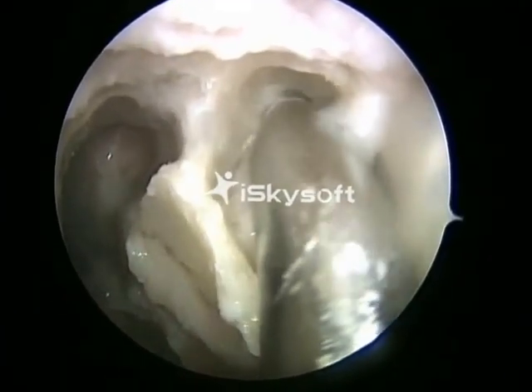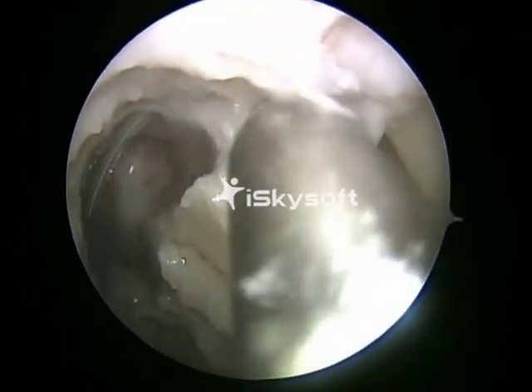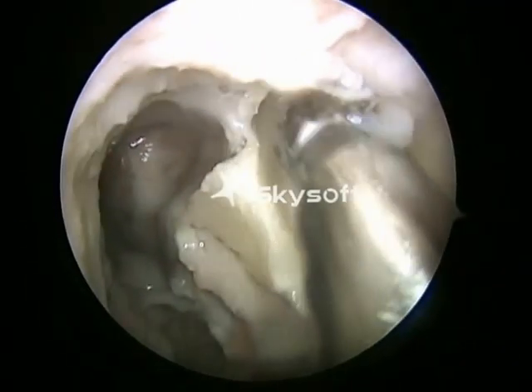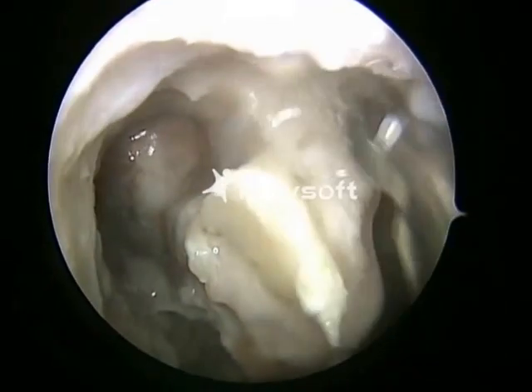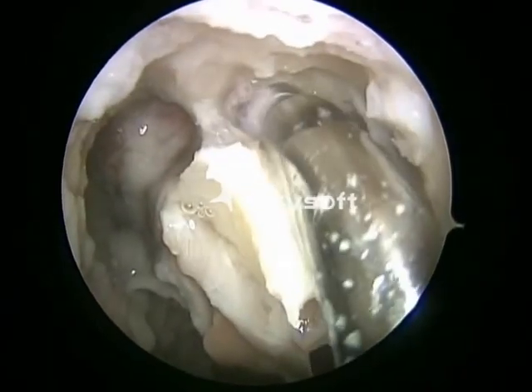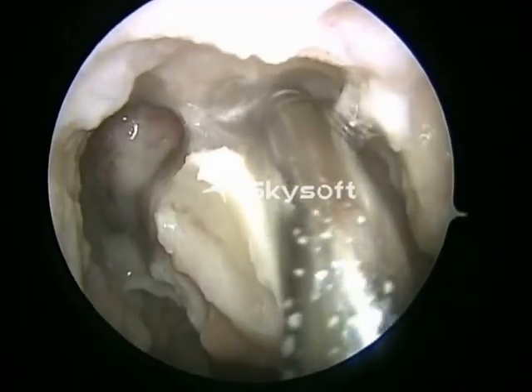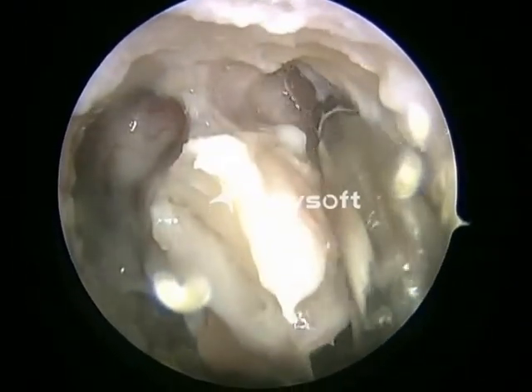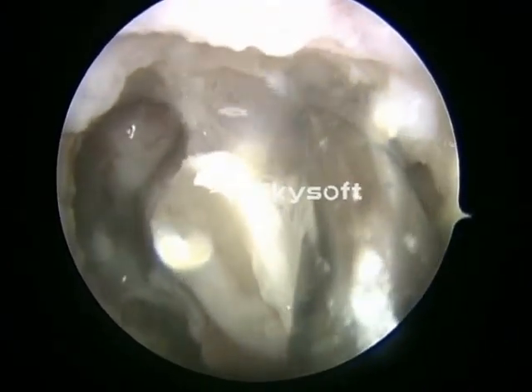Modified endoscopic Lothrop for frontal sinus procedures can be used for refractory frontal sinusitis. It can be used for inverted papillomas, esthesioneuroblastomas, osteomas of the frontal sinus, laterally based cells, and fractures of the posterior table of the frontal sinus.